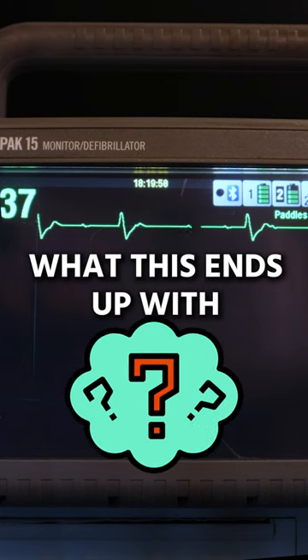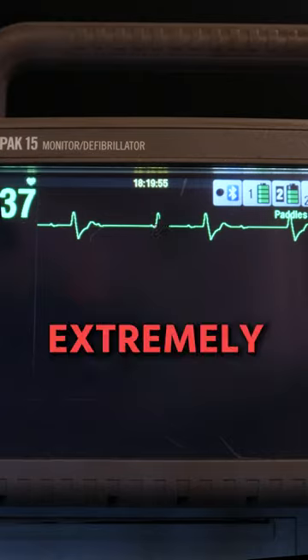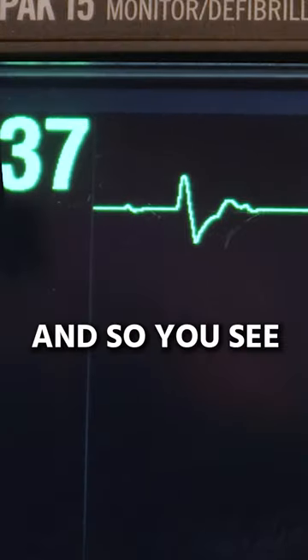So what this ends up with, P's and QRSs are firing at random, and we have an extremely, extremely low rate. And so you see here, the heart rate's about 37.